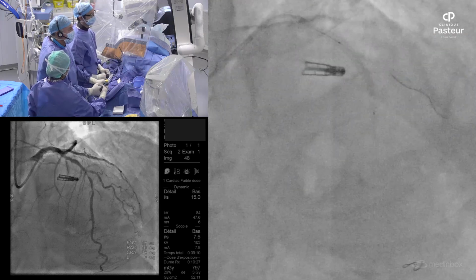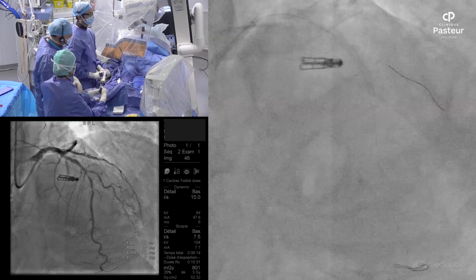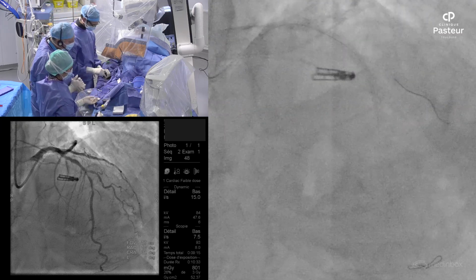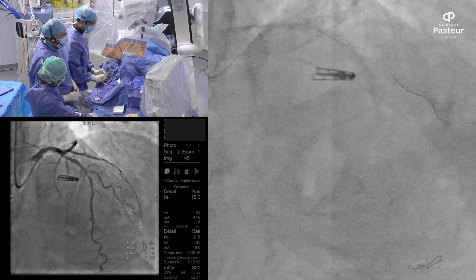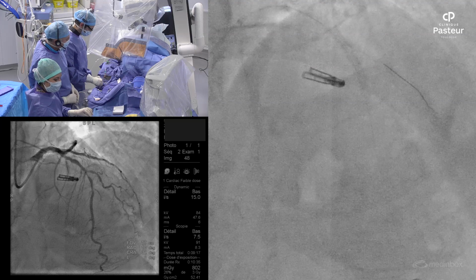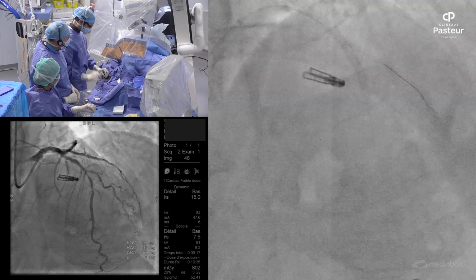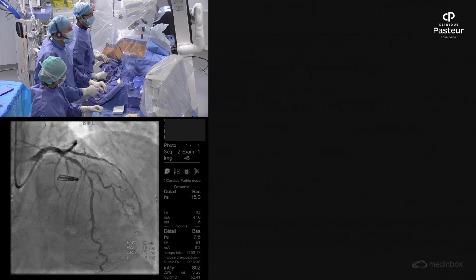So definitely you decided for a provisional stenting, so one stent in the main, and then we evaluate the second one. Does anybody think that this was a case for starting with a dual stent technique? No. Good. No, always you agree. It's an octogenarian patient. I think that if the patient has only the diagonal branch, we will leave it medically.